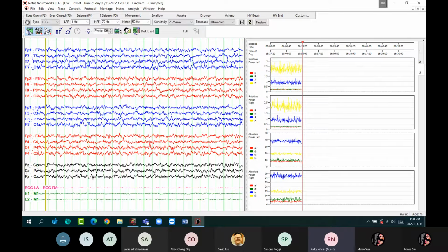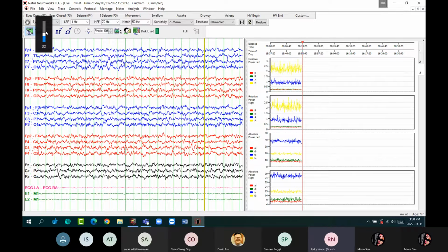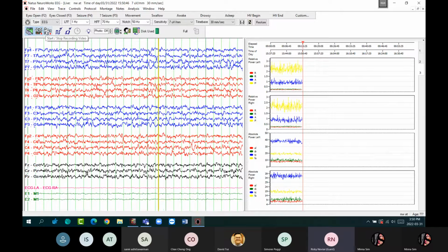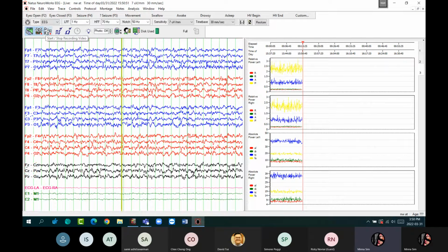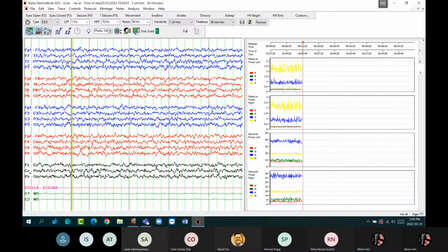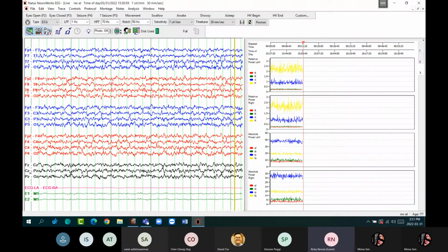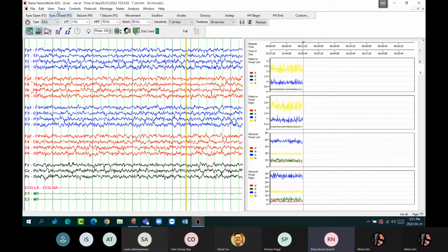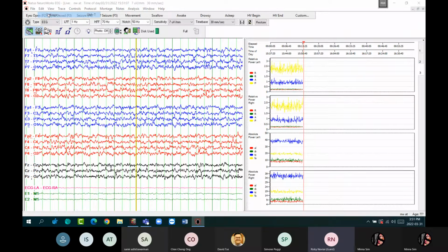Before that, you mentioned the analysis profile and the trends profile. Does that profile depend on the doctor, or is there a default setting in NeuroWorks? Which profile again? Two of them, the analysis profile and trend profile. Does it depend on the doctor, or is there a default template or default setting from the NeuroWorks software?